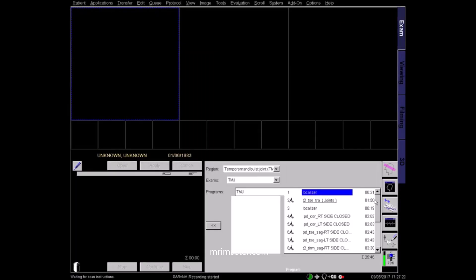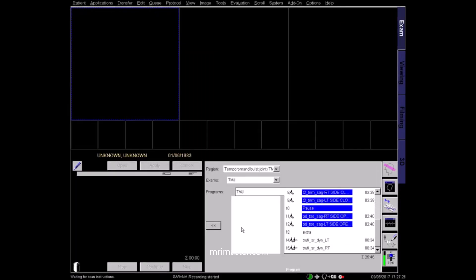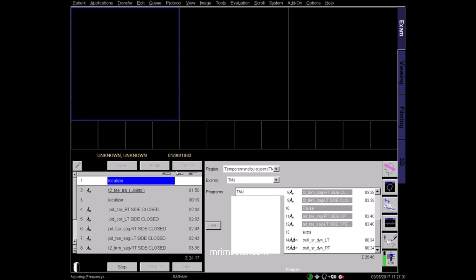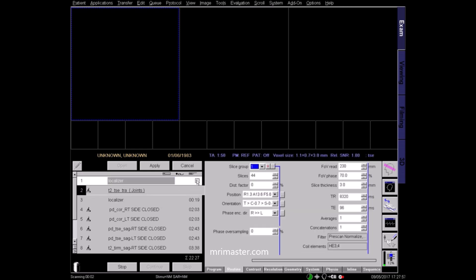Here we'll demonstrate how to plan a scan of the temporomandibular joints or TMJs. The TMJ is a synovial joint comprised of the condyle of the mandible and the mandibular fossa of the temporal bone, with an articular disc in between. Select the correct protocol according to your hospital and radiologist guidelines.